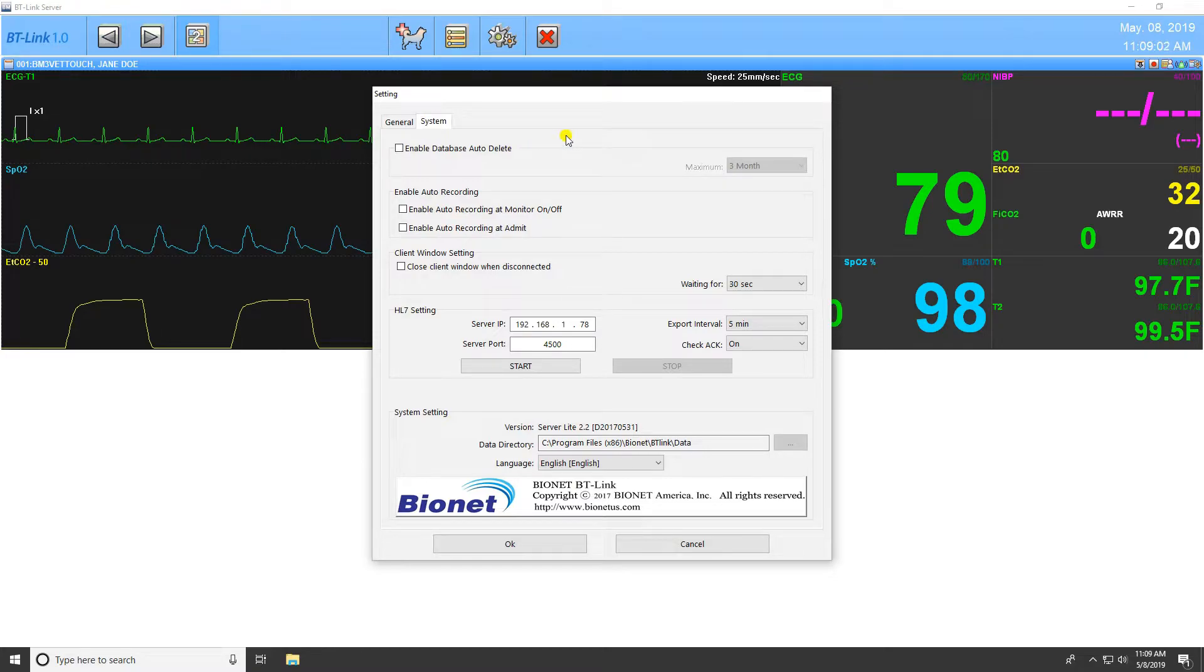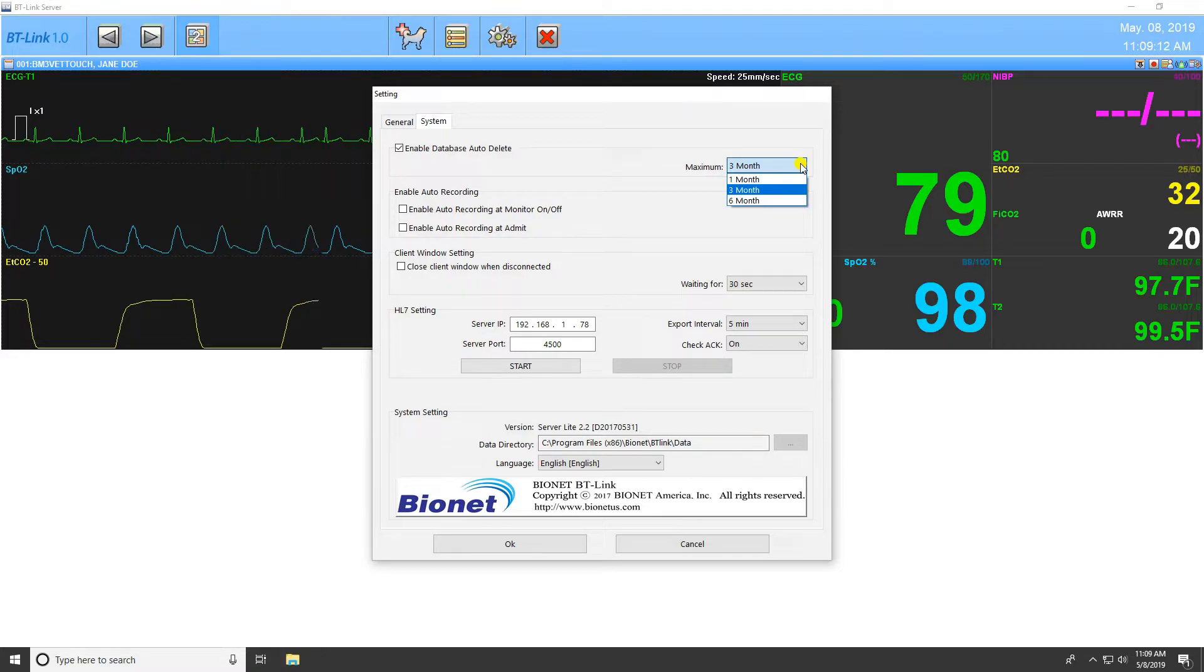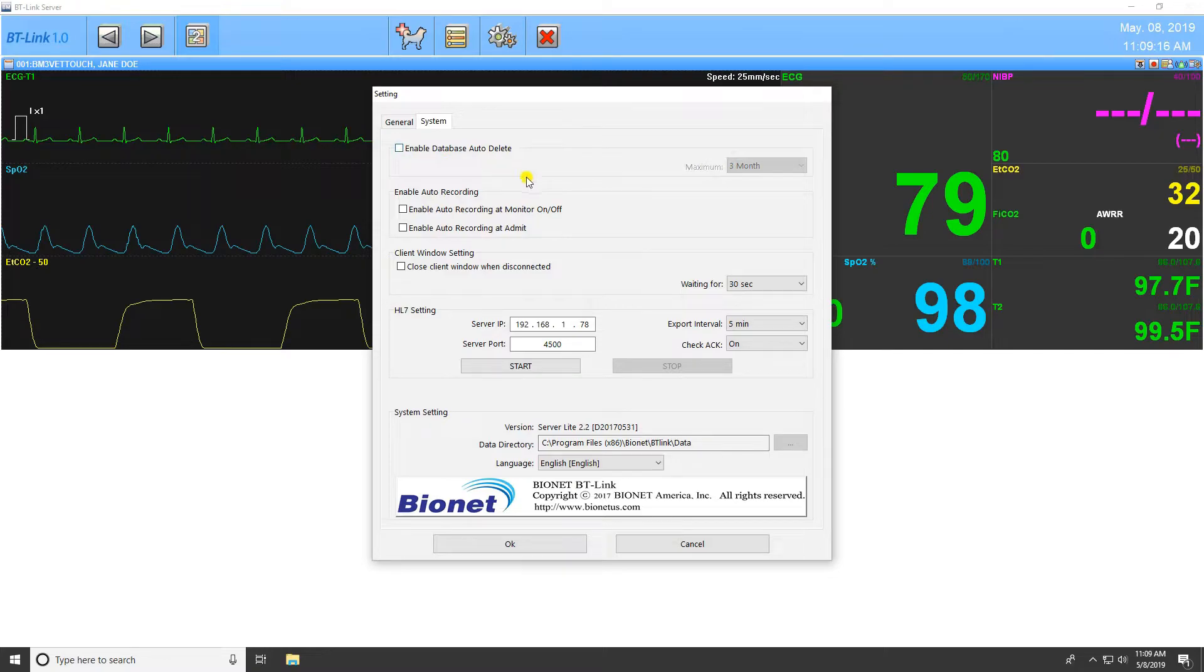The next tab is the System tab, which offers additional settings for BT-Link. The first setting is the Database Auto-Delete. Enabling this setting will automatically delete any data older than the setting on the right. The Maximum Duration setting can be set to 1, 3, or 6 months.